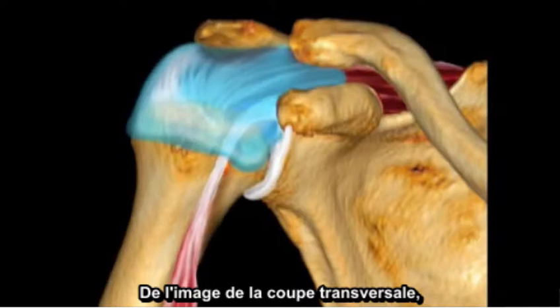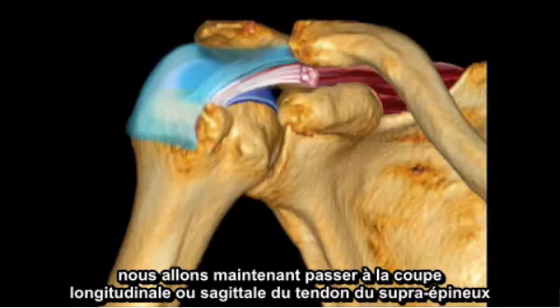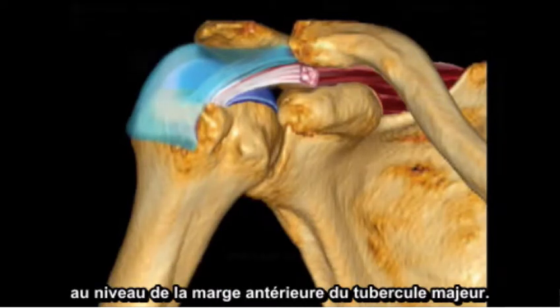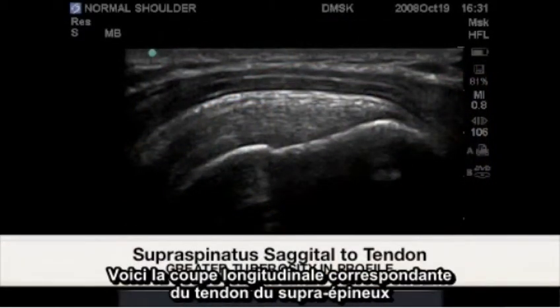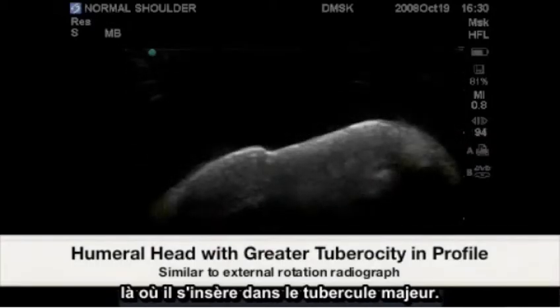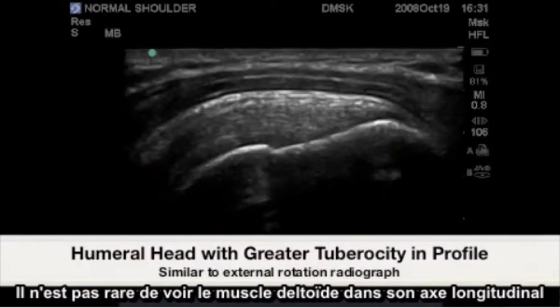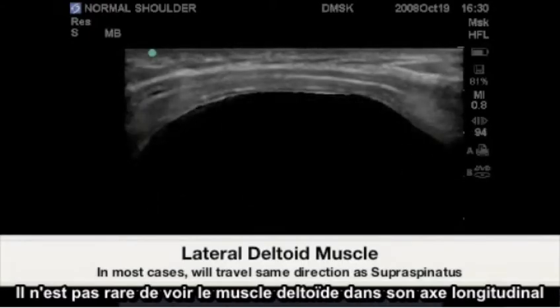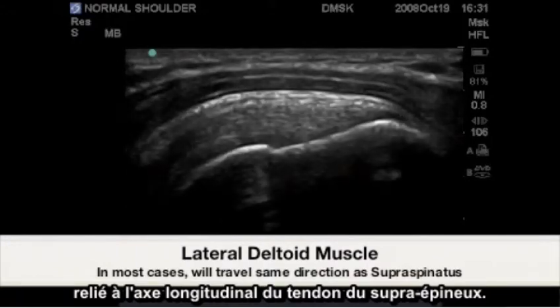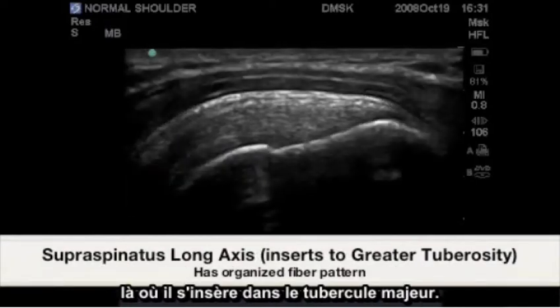From the transverse or cross-section image, we will now switch to the long axis or sagittal cut of the supraspinatus tendon at the anterior margin of the greater tuberosity. Here is the corresponding long axis section of the supraspinatus tendon as it inserts to the greater tuberosity. Highlighted here is the humeral head and greater tuberosity in profile. It is not uncommon to see the long axis deltoid muscle in relation to the long axis of the supraspinatus tendon. Highlighted in the next image is the long axis of the supraspinatus tendon as it inserts to the greater tuberosity.